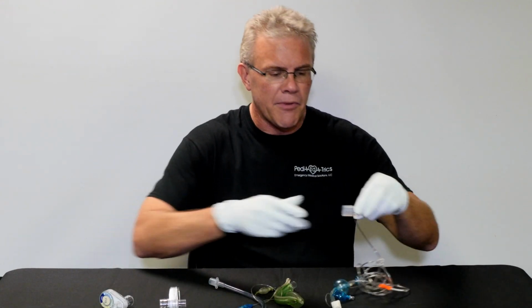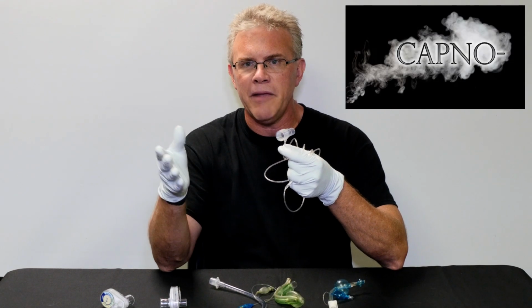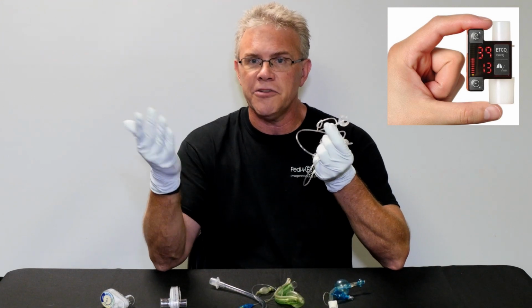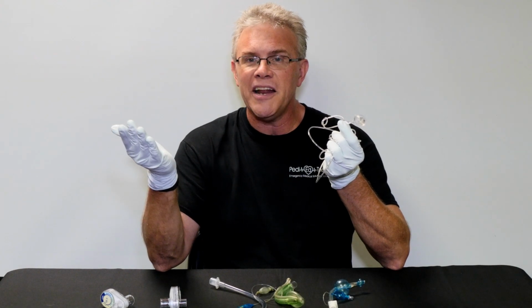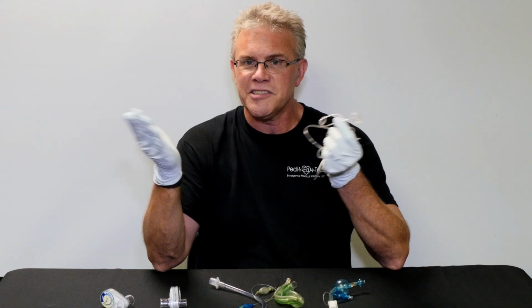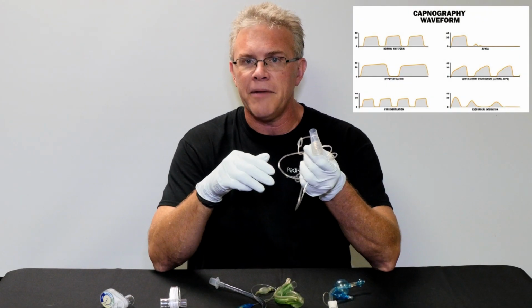So that's where, remember, for several years, capnography has come into play. And capnometry, remember, just simply means, capno comes from Greek, meaning smoke, and capnometry is when you look and it just gives you a number. So they have devices that you hook on the end of the tube and it just gives you a number and it says your CO2 is 40. And that's great because your CO2 is 40, your tube's in the trachea. But if it doesn't give you a waveform, that's important because that's like saying the patient's heart rate is 160. What's the rhythm? Well, I don't know. All I know is their heart rate's 160. It could be any variation of rhythms. It's just simply 160. So that's good, but that's why we've gone to some variation of capnography.